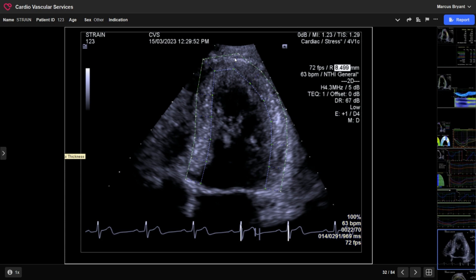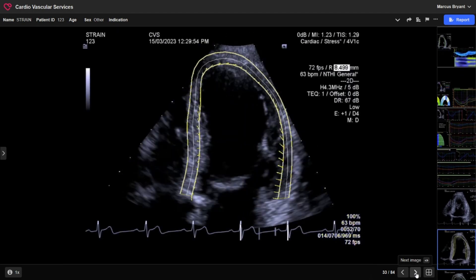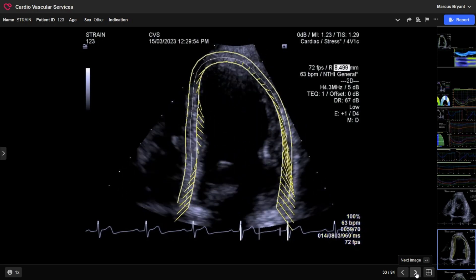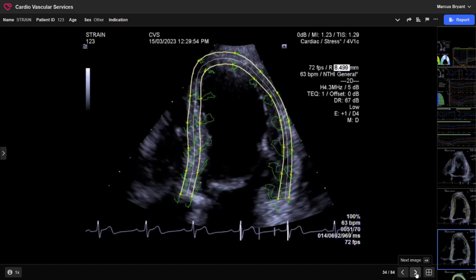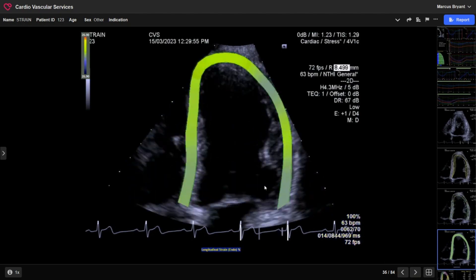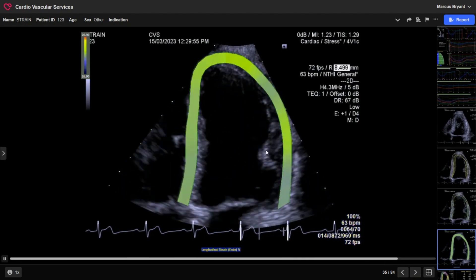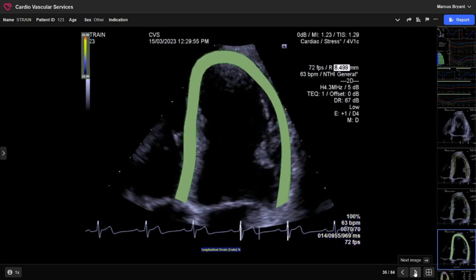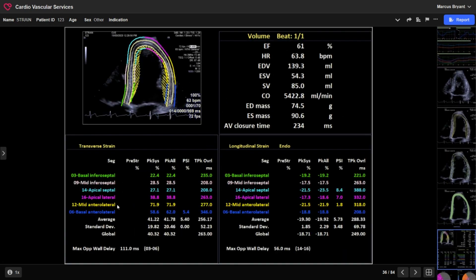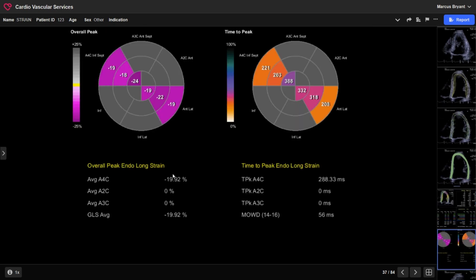If you want to turn on full thickness strain, you end up with a sector like this, and then you can change the thickness using the up and down arrows. You want to include the epicardium but not the pericardium if possible. This is the default display just with velocities on using the epicardial contours, and then this is a more classic color display which you'll often see on a lot of other machines, giving you some more numbers in terms of what's actually going on.